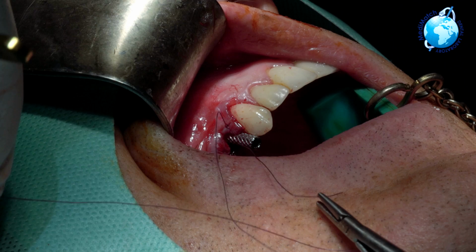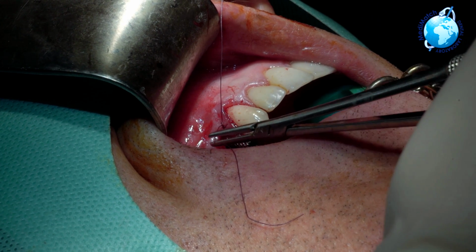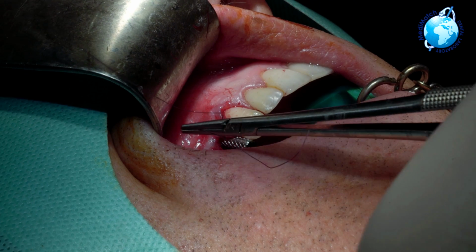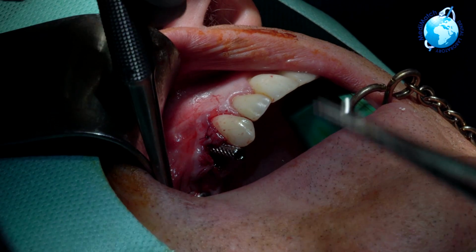Just one more going across there. Perfect. Good.